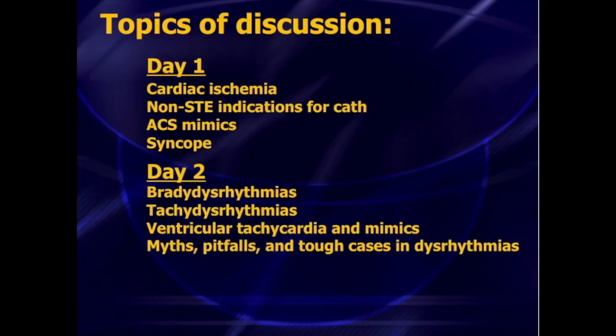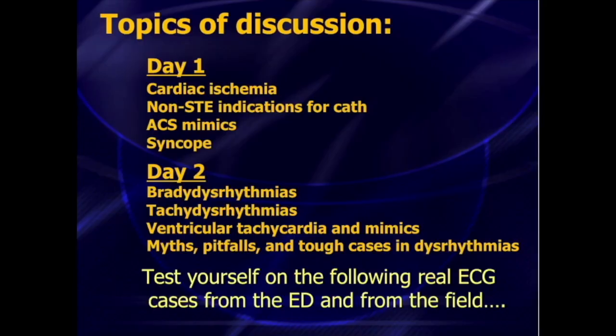Day 1 is largely focused on cardiac ischemia as well as syncope, and day 2 is all about cardiac dysrhythmias, including myths, pearls, and pitfalls, and many of the misconceptions that we've been taught that relate to ACLS in particular. I always tell people, if the sum total of your knowledge of how to take care of patients is based on ACLS, people are going to die. You need to take your skills beyond ACLS and beyond what you learned in medical school and residency, and that's what this course is all about. Let me show you some of the cases that we're going to discuss.